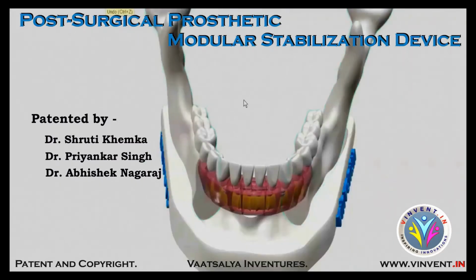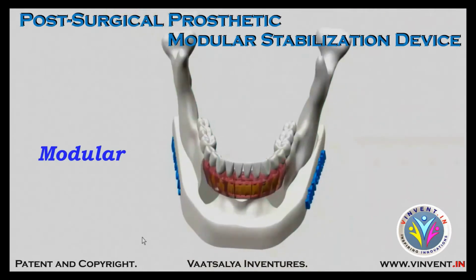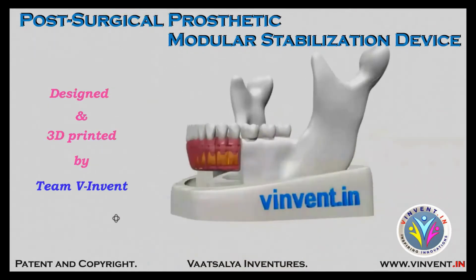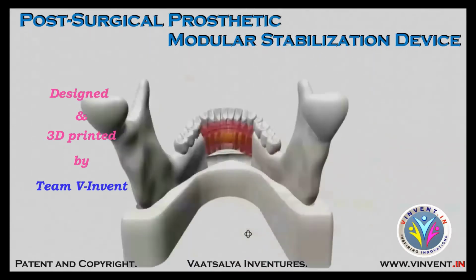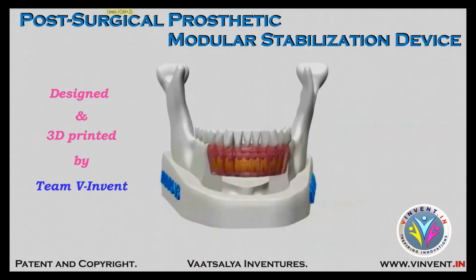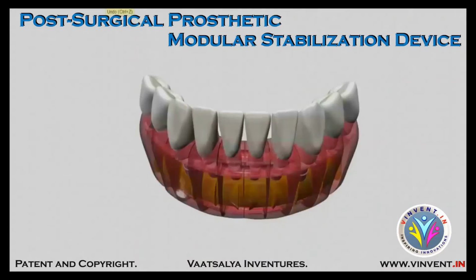The unique feature of this device being it is modular in nature, that is, it is made up of multiple components which can be added and removed based on indication. This is a video to explain and demonstrate the parts and assembly of this patented innovative device.